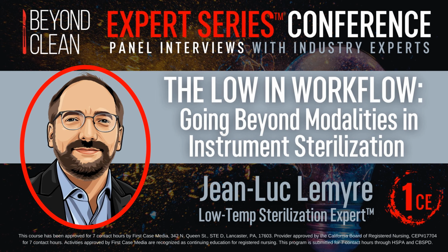They work in different ways, and this also has an impact on the way they would be used in an SPD. So one key difference is that peroxide works as a chemical sterilant and acts only on the surface. The peroxide molecule has to be able to reach wherever there's a bug to sterilize. Steam, on the other hand, is a physical process, so it's the heat and pressure that will destroy the bugs and can go deeper, because the heat transmits through material. That's one of the reasons why with an autoclave you can sterilize liquid, but not with peroxide.